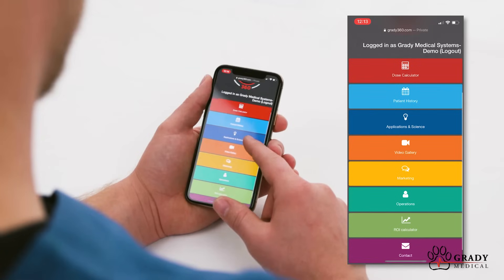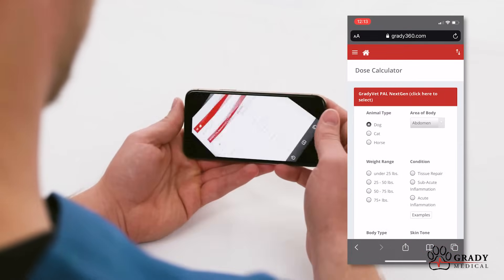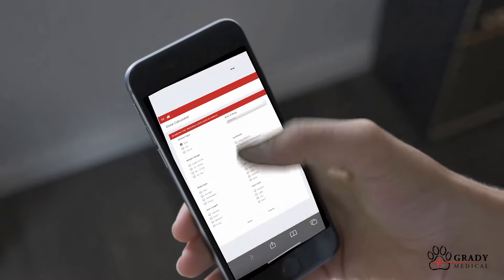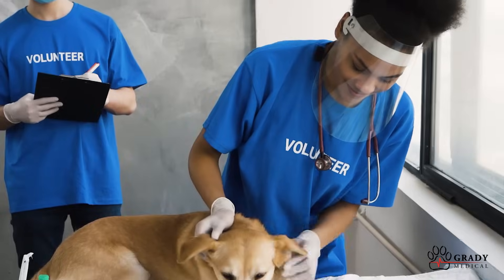The Grady 360 web application features a built-in dosage calculator that generates treatment protocols simply and accurately. Using any device, including a computer, tablet, Apple, or Android smartphone, you can access patient history, training content, industry research articles, treatment calculators, and more.